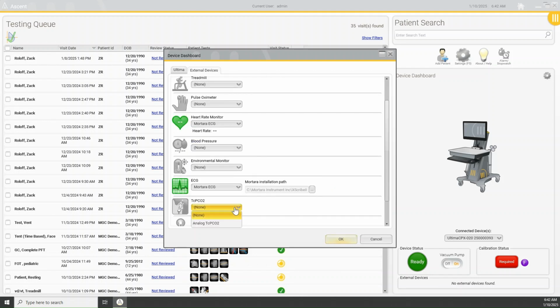One area that comes up is the transcutaneous output, or it's coming up because people are talking about it more and more. So we do interface with that signal. It is an analog signal, but ultimately it allows for the dynamic display of dead space to tidal volume ratio, or VD/VT. So this is a nice feature that people have been asking about for the last 4 to 6 years.